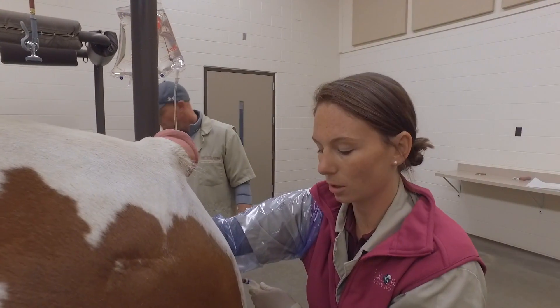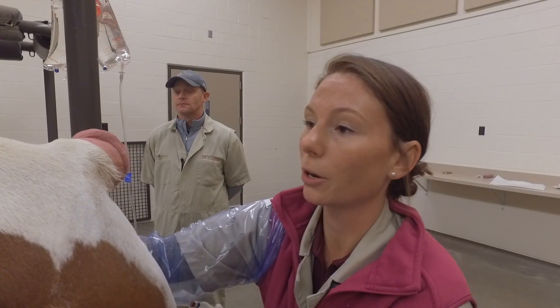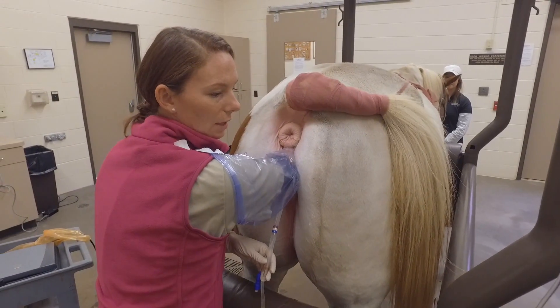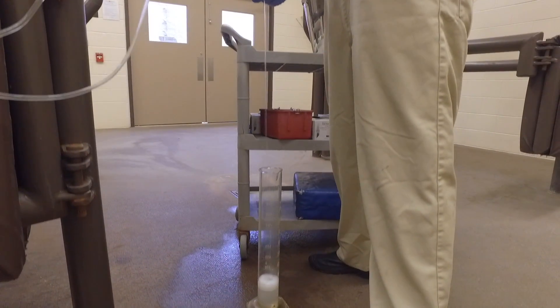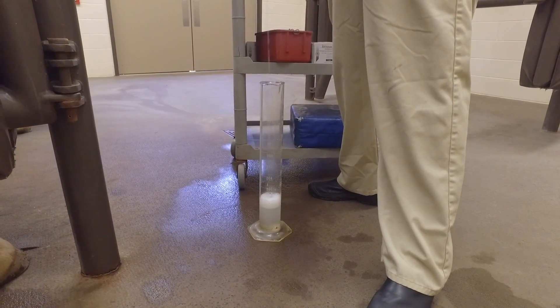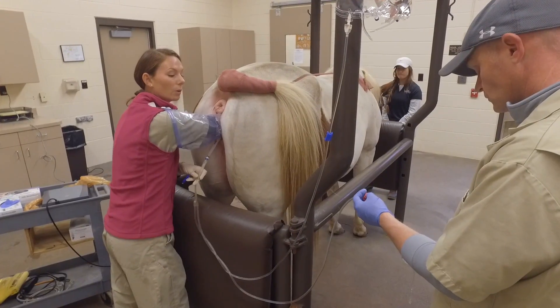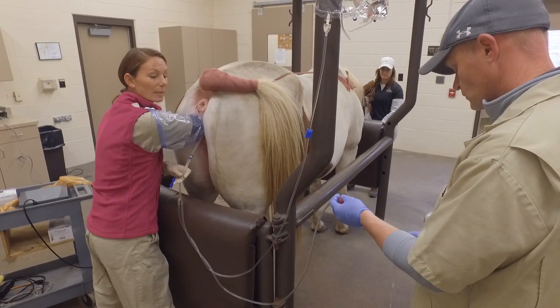Fluid is going into the uterus now, and we'll hopefully get this whole bag into this mare — she's big so we'll be able to fit that in her uterus. Now we're siphoning the fluid from the uterus through the embryo filter that Dr. Scoggins is holding there. The embryo gets trapped in the filter and into that little dish so that we don't lose it as we're siphoning out the fluid. Usually we'll wait until there's no more flow, then we can place more fluid into the uterus or go in with our ultrasound machine and scan to make sure most of the fluid has been siphoned out.